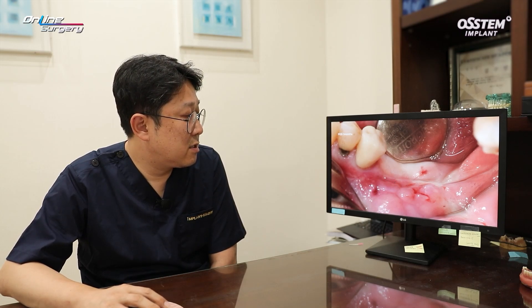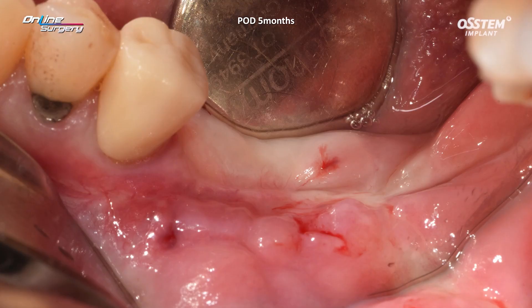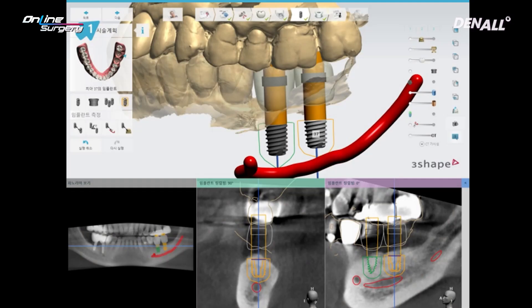About 5 months after grafting, healing was properly progressing as you can see. However, scar tissues are abundant in the soft tissue and the keratinized tissue width is very narrow. It was necessary to make efforts to improve soft tissues when placing the implants.